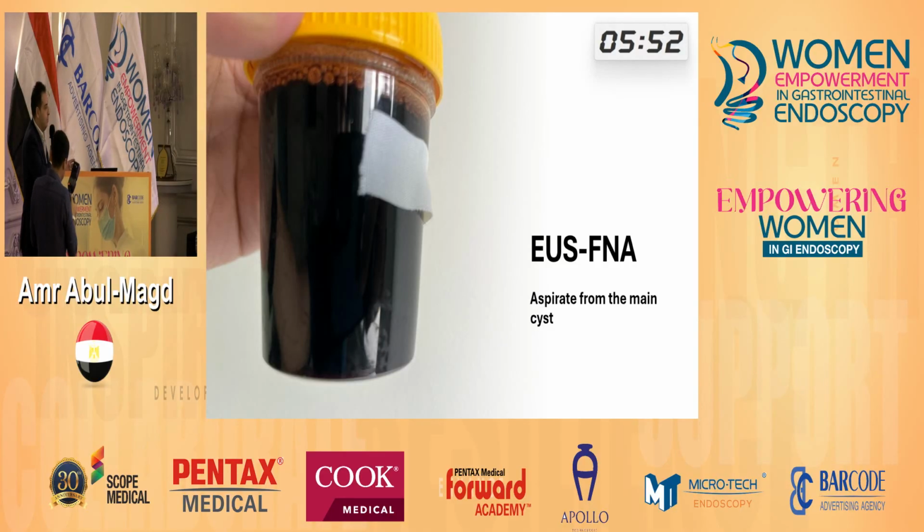So I started to hesitate again. This is the classic view of a pseudopancreatic cyst. The decision will change again. Completely restricted to Dr. Amr Al-Fouli's concept.